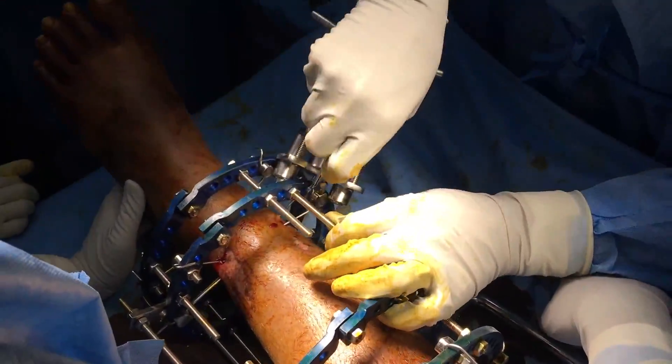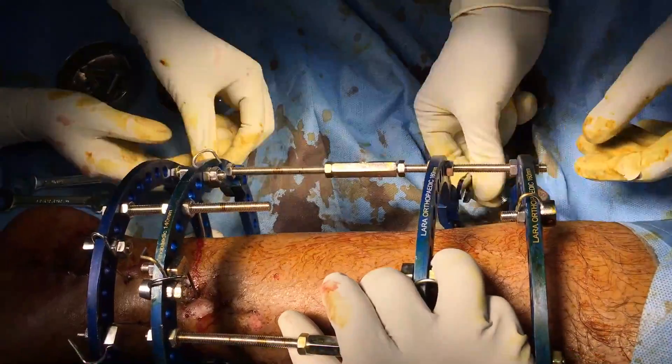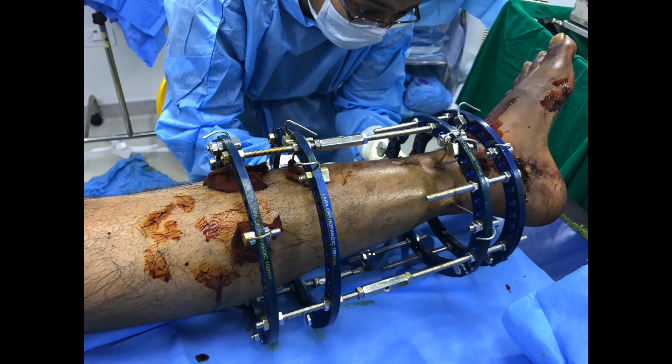The manual tensioner is only used when we tighten the olive wire to correct the side-to-side shifts of the frame. Another inspection under C-arm tells us that the fracture is not only correctly reduced in both antero-posterior and sagittal directions, but there is also an element of compression.